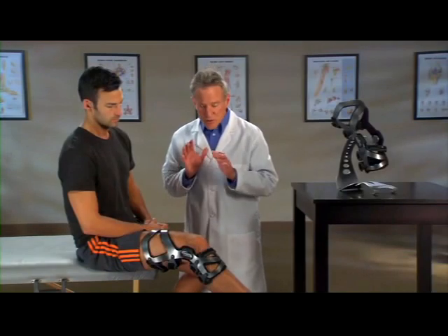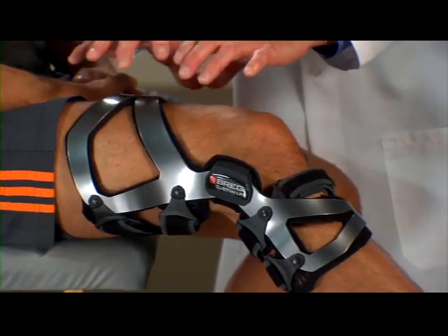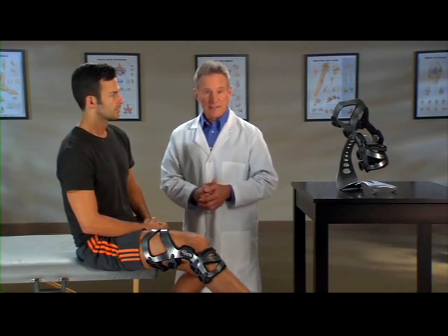Second, the brace works with your anatomy. See this large opening in the front? This is to accommodate your thigh muscle. The LPR doesn't interfere with this major muscle, so you're free to move unencumbered.